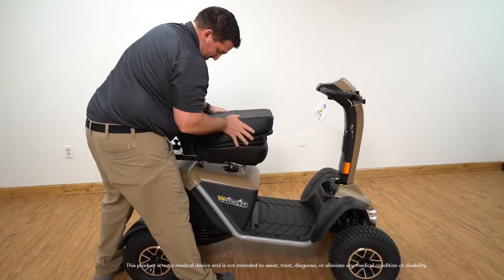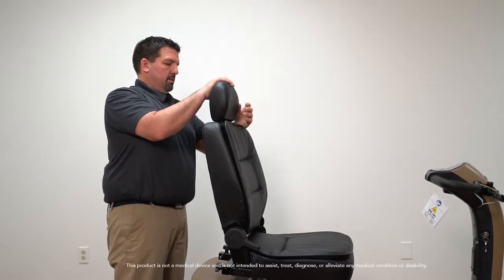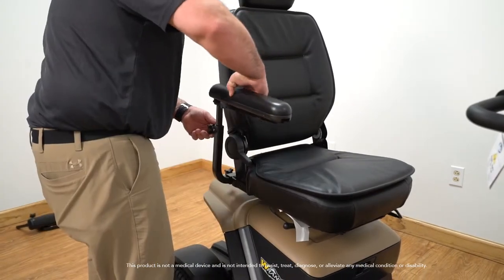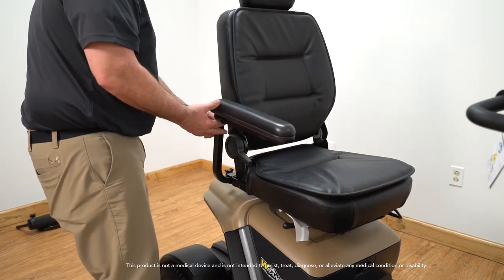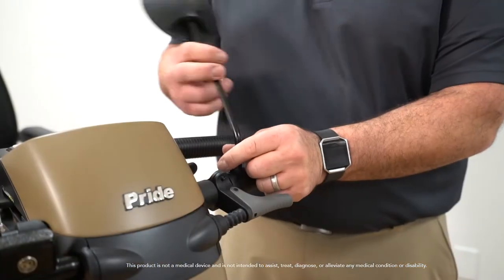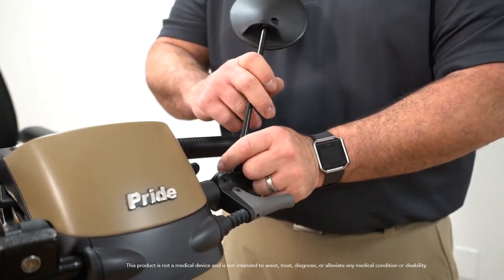Attach the seat to the seat post along with the headrest. Then attach the seat arm rests. It is best if you leave three quarters of an inch space when lowering the arm pad. Attach the mirror and adjust to your liking. Now your Wrangler is set up and ready to go.